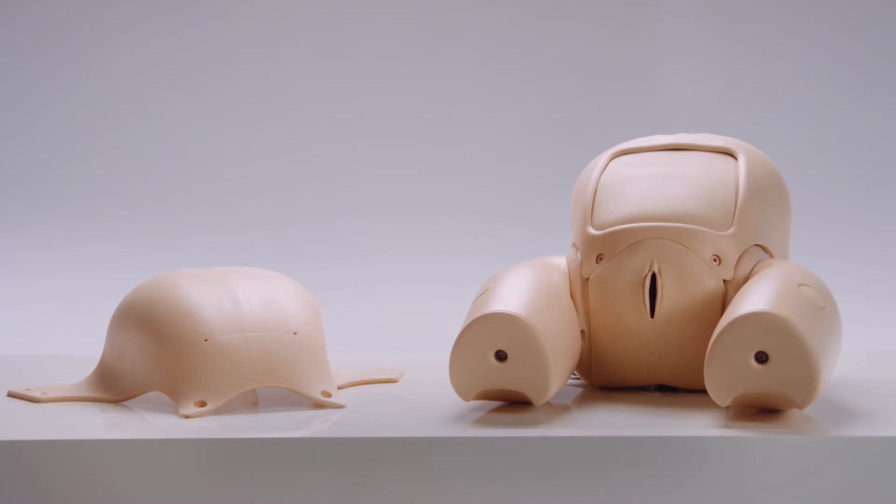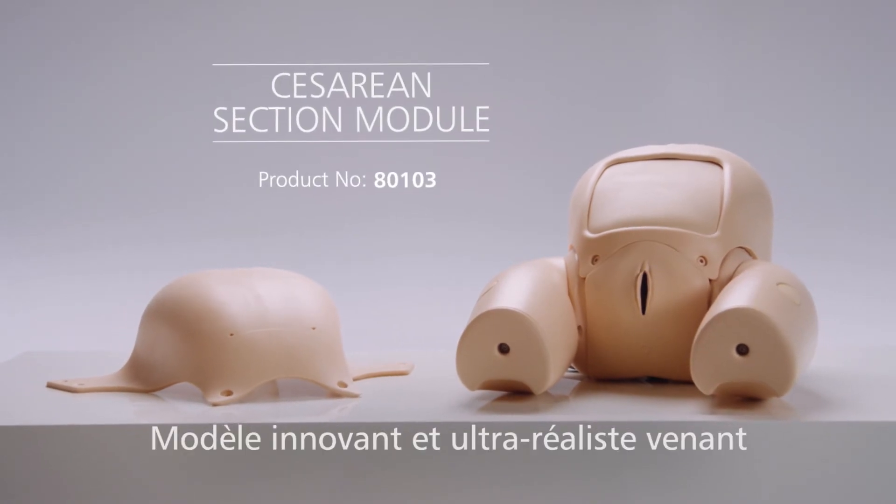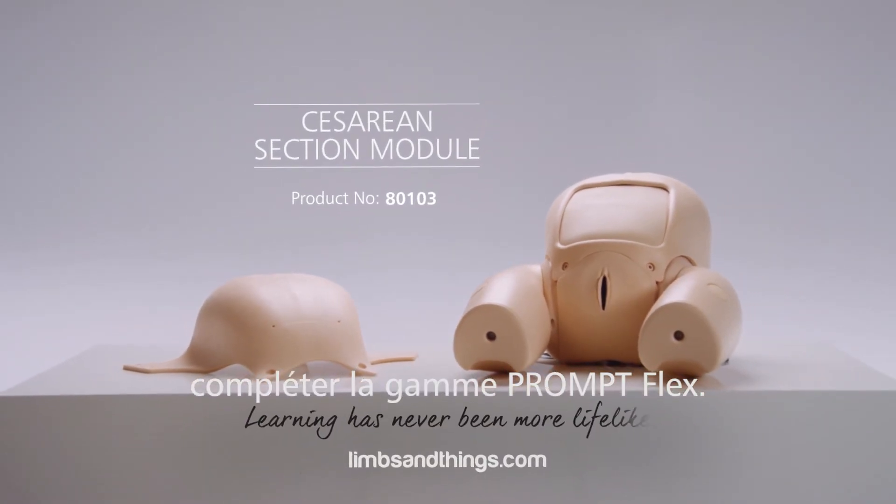The Cesarean Section Module provides an innovative and highly realistic extension to the Prompt Flex range.